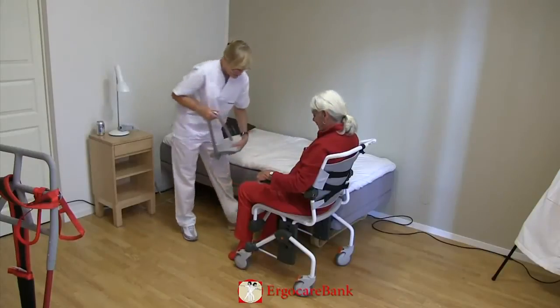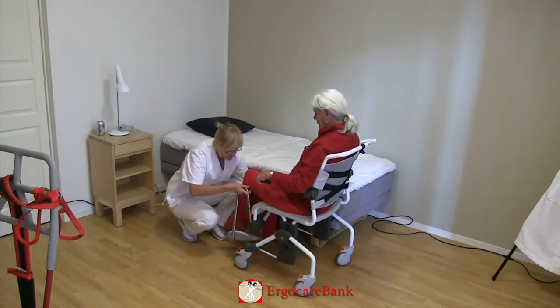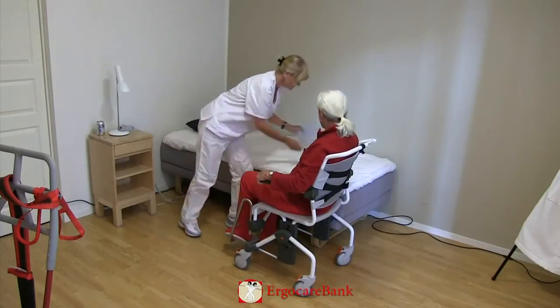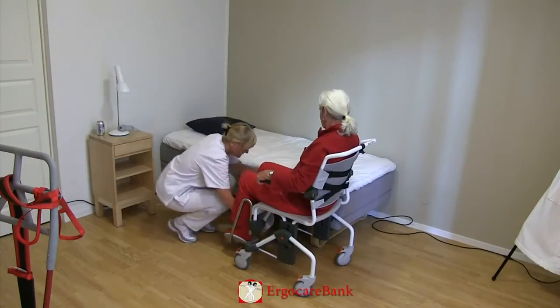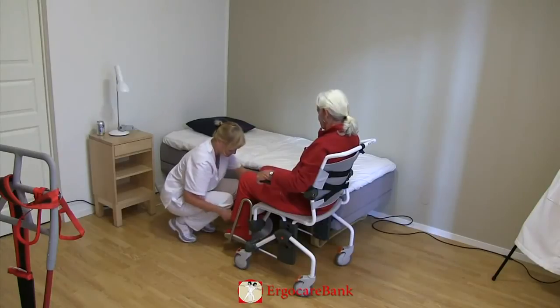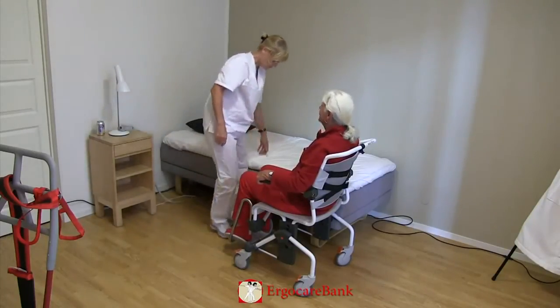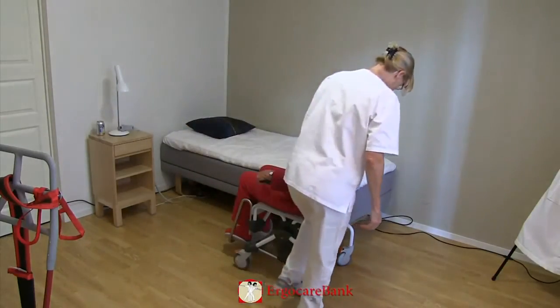The foot rests of the shower chair are put back on. The brakes of the shower chair are unlocked.